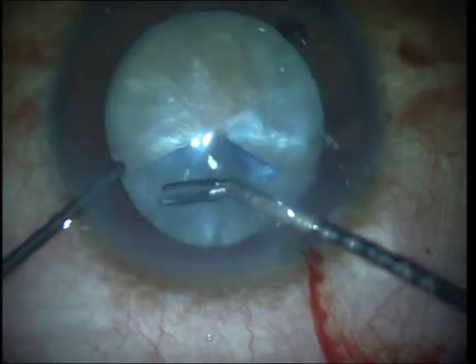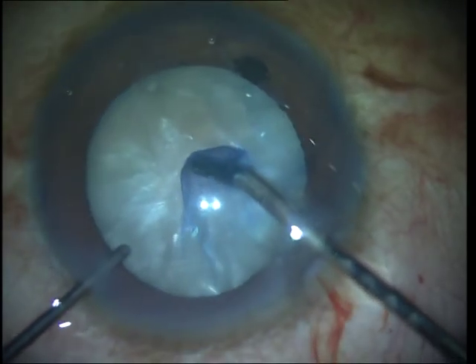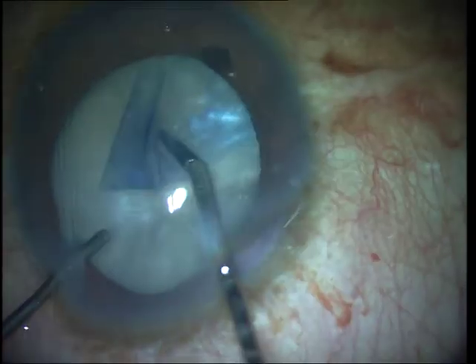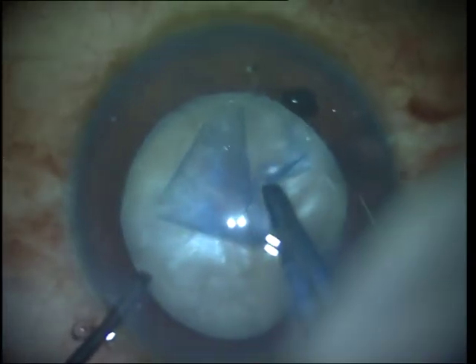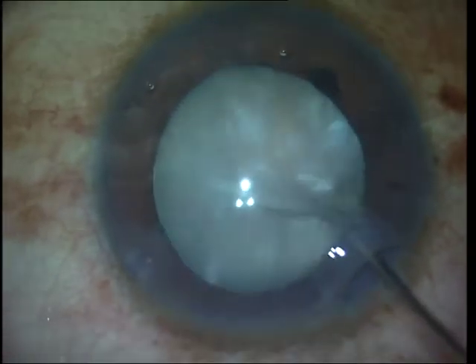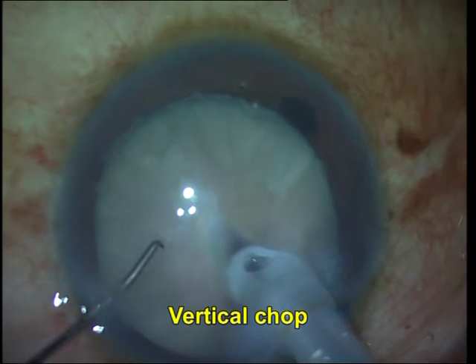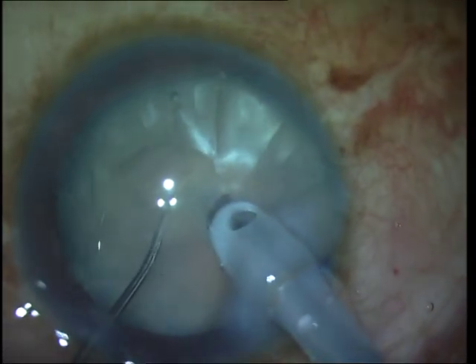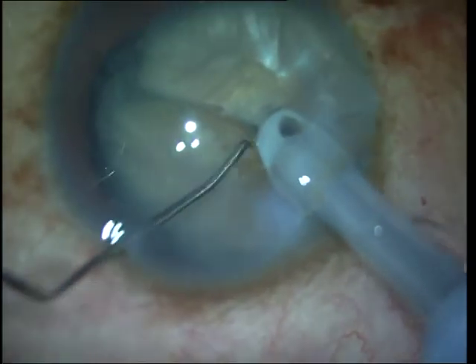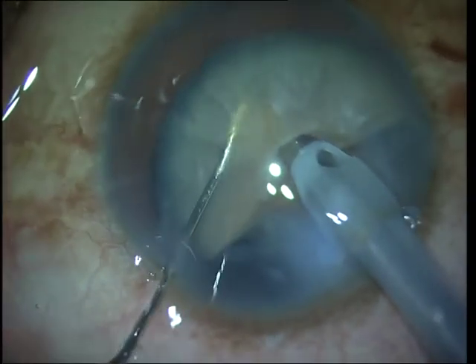One always needs to keep the option of converting to extracapsular cataract extraction if required. I am therefore performing a large enough rhexis in case I need to convert, and in which case I could dial the nucleus out through a large enough rhexis - either intact or after creating two relaxing cuts. Again, gentle multi-quadrant focal hydrodissection and gentle rocking of the nucleus to release fluid is done before further hydrodissection. Viscoelastic is instilled, and since more energy is expected, a dispersive viscoelastic is used to coat the corneal endothelium. The vertical chop with the smaller sharp chopper is possible, but you may need to go deeper and deeper into the initial crack so that it propagates throughout the entire thickness of the nucleus.